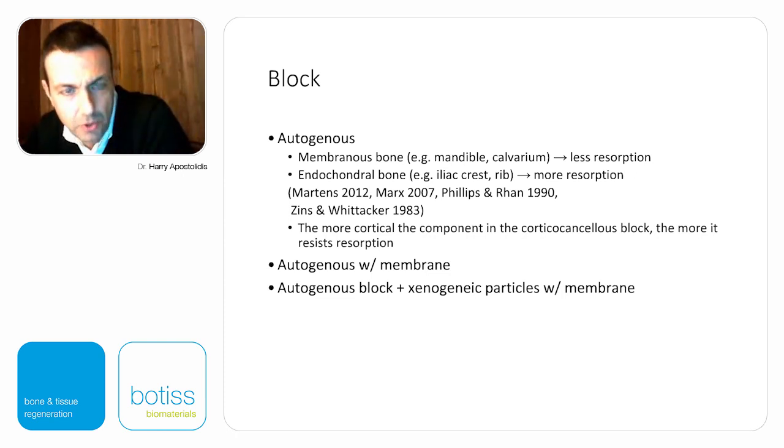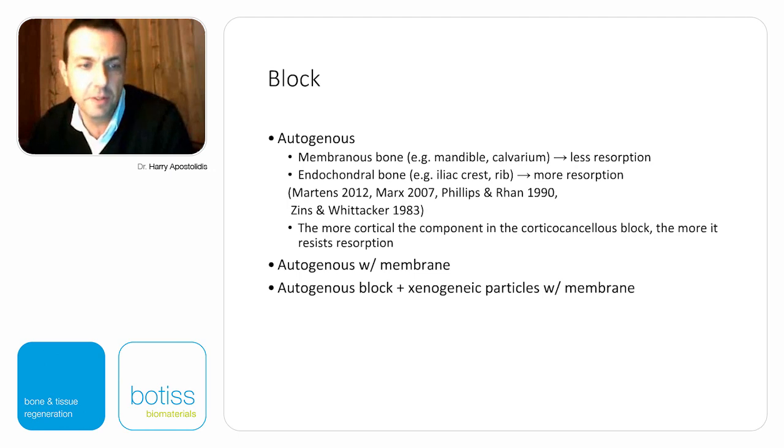So we used to use autogenous bone blocks by themselves. Lately, we use them with a membrane or with xenograft particles around the block and with a membrane for better results.